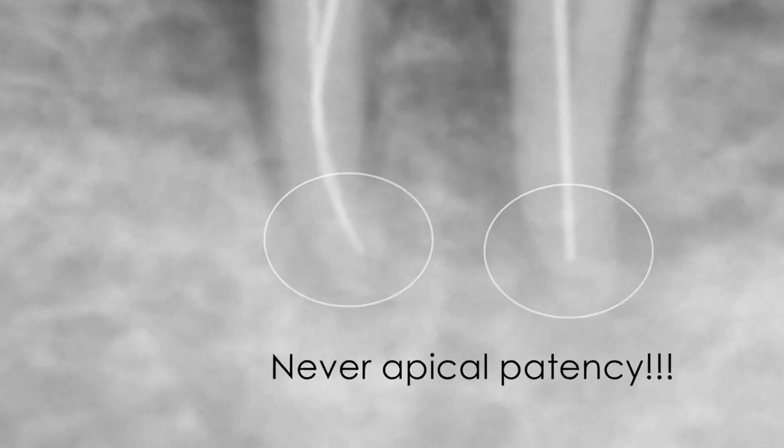Respect the established working length. Use your instruments manually in the apical third for better control. Do frequent recapitulations with smaller instruments. Never apical patency.